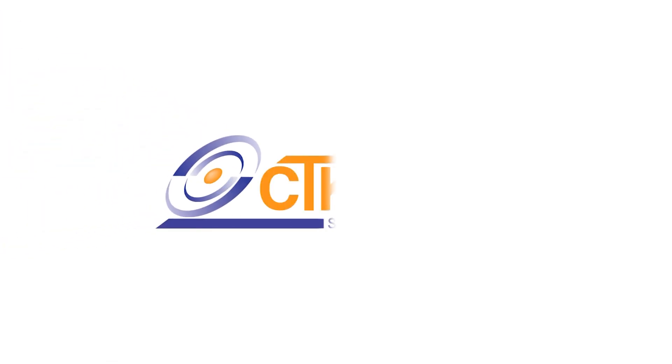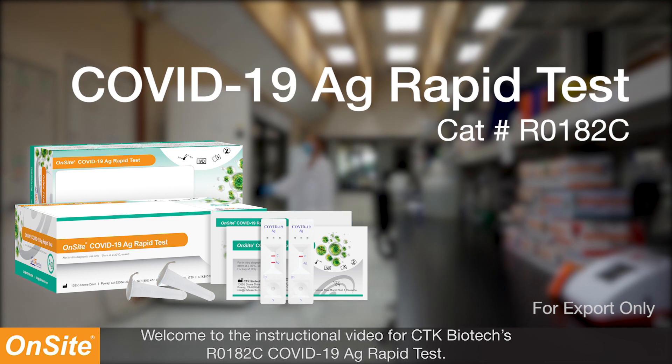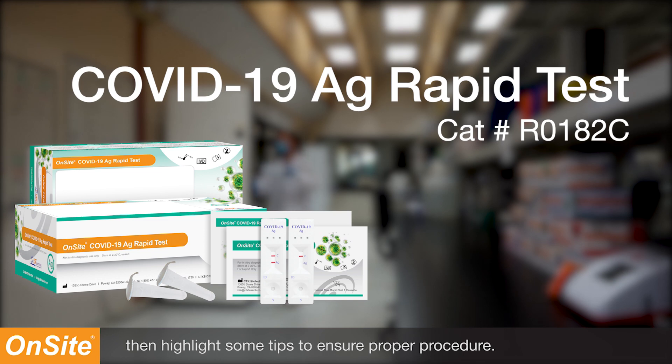Welcome to the instructional video for CTK Biotech's R0182C COVID-19 antigen rapid test. Today we will go over the test procedure, then highlight some tips to ensure proper procedure.